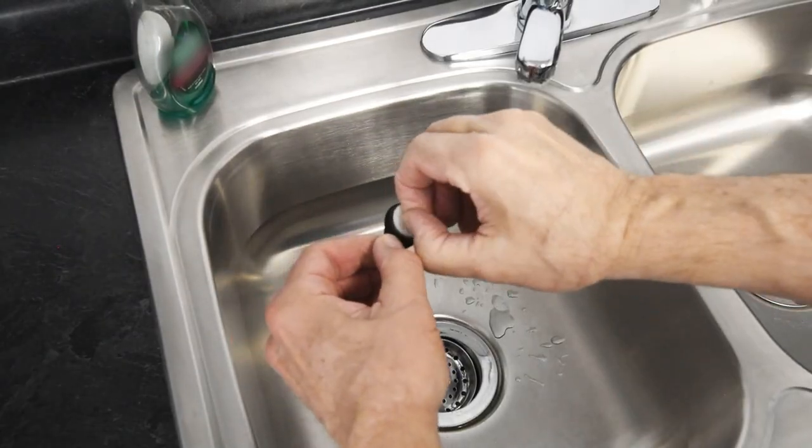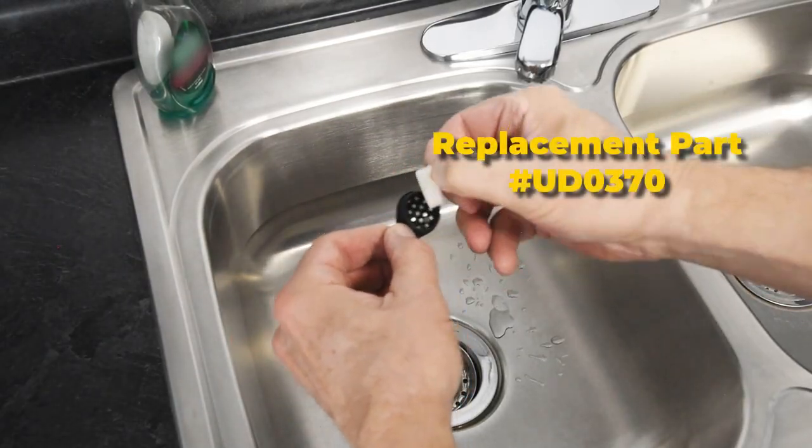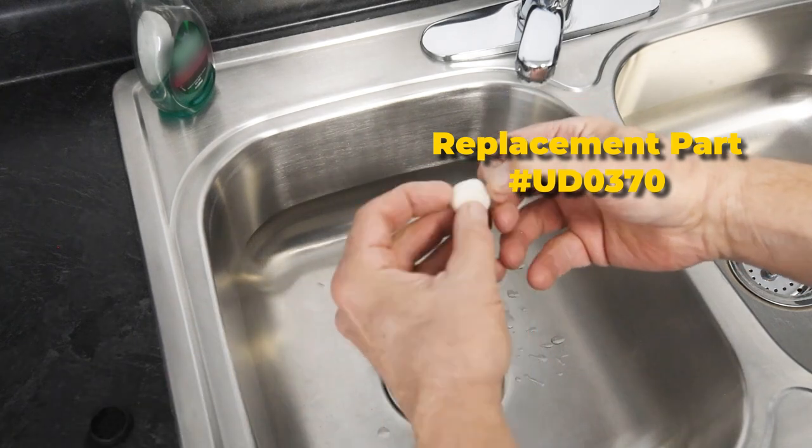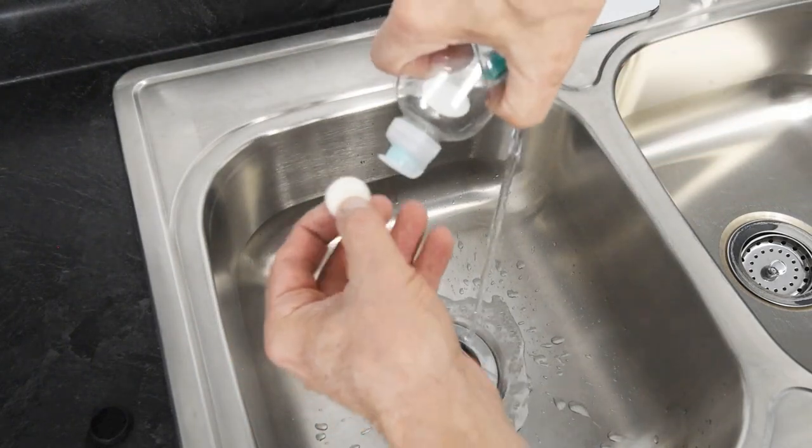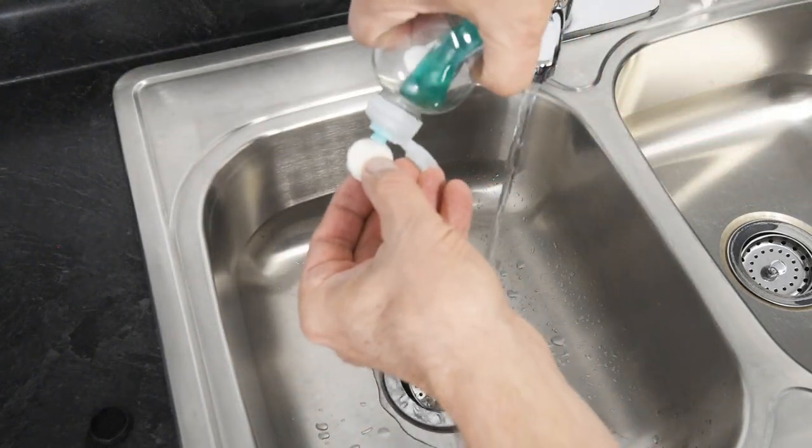The filter element is located inside the cap and can be removed for cleaning and/or replacement. Clean the filter element and cap with warm water and mild detergent. Ensure they're completely dry before reassembly.